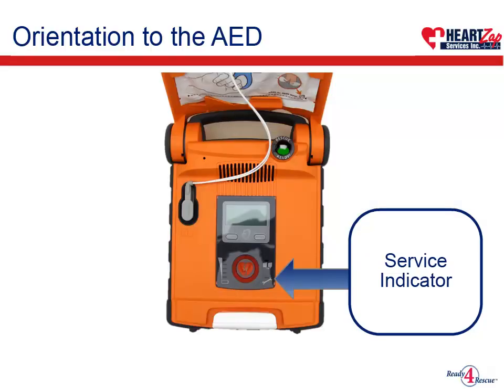Service indicator. This indicator lights when the AED detects a need for maintenance or service. Should this occur, please contact HeartZap Services Inc. to troubleshoot the issue and make arrangements to receive a loaner AED if required.